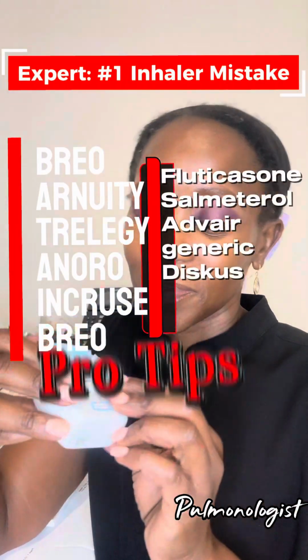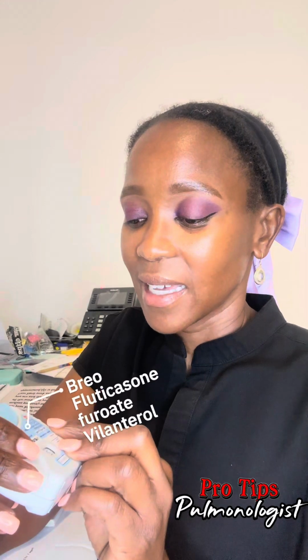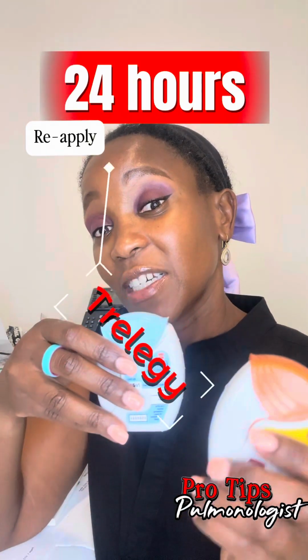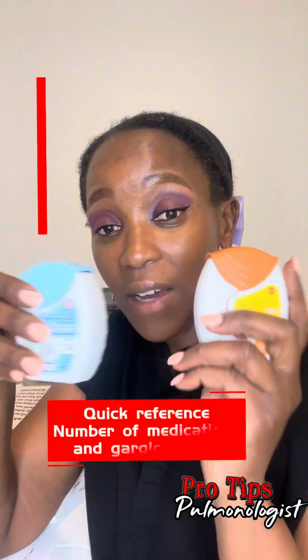Breo. This is Fluticasone, and it has Vilanterol. These are 24 hours. So is this, and so is Trelegy, right? They're all once a day. However, one medication, this has two. You've got to rinse after both of these.